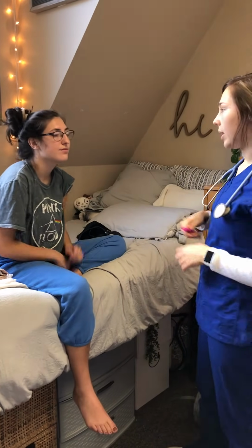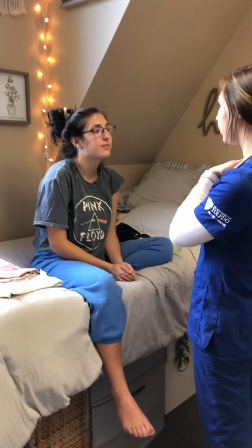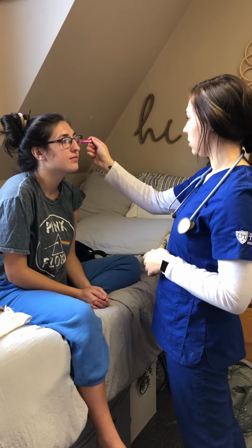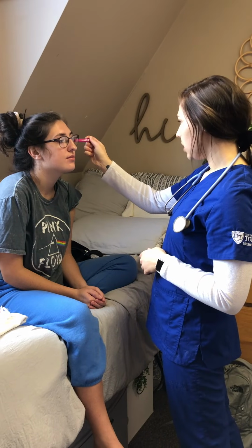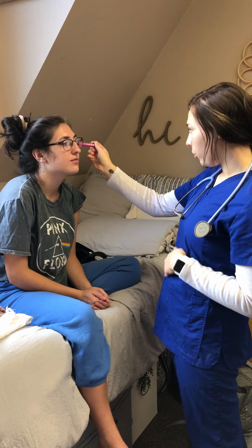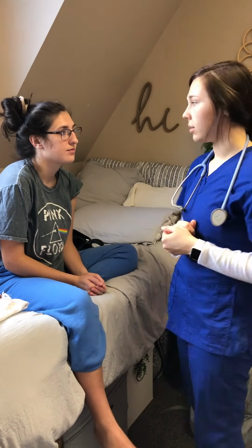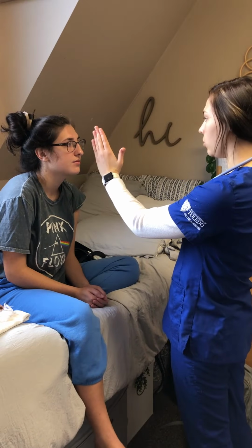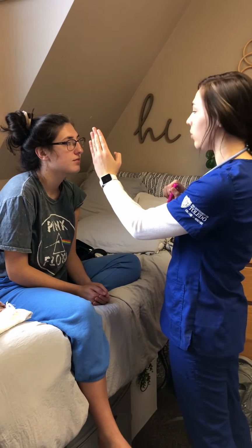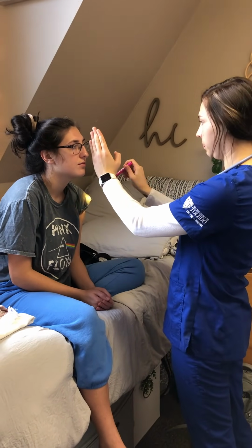Pupils equal, round, and reactive to light and accommodation. So I'm just going to have you look over my shoulder, and the first thing I'm going to do is measure your pupils. So just by measuring, it looks to be about 4 millimeters, and they're both the same size and both round. And so now I'm going to do reactivity to light, indirect and direct light. So I'm just going to place my hand here and just keep looking over my shoulder. So the first thing I'm going to do is shine direct light into her left pupil and observe for constriction.